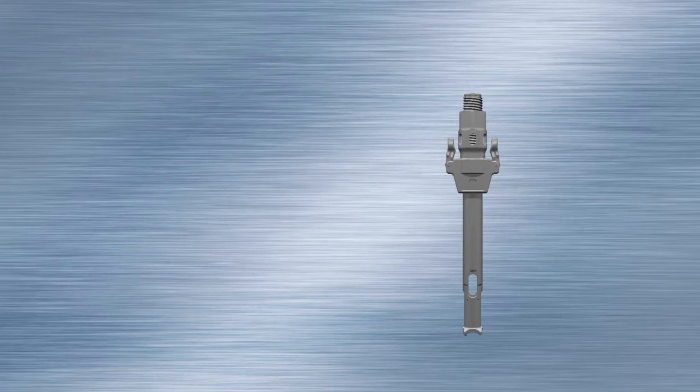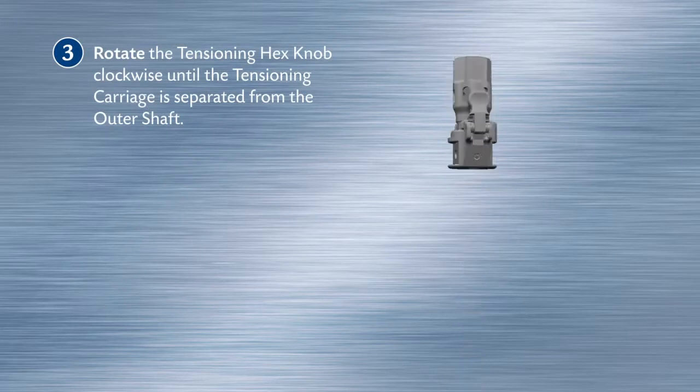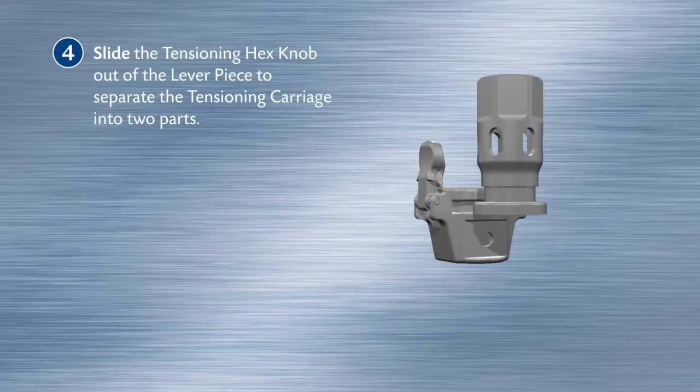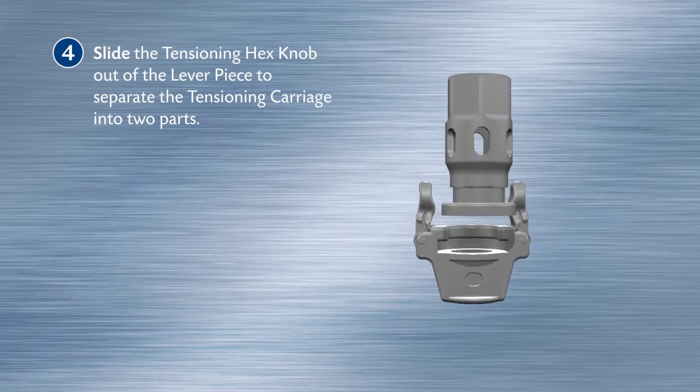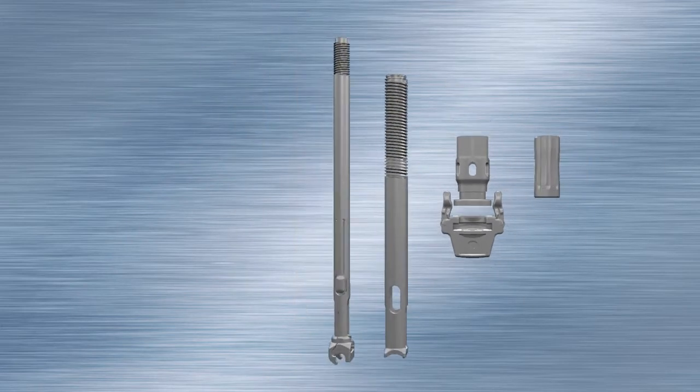Rotate the tensioning hex knob clockwise until the tensioning carriage is separated from the outer shaft. Slide the tensioning hex knob out of the lever piece to separate the tensioning carriage into two parts. The SILK tensioner is now fully disassembled.